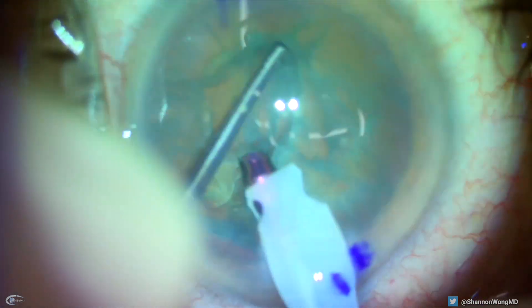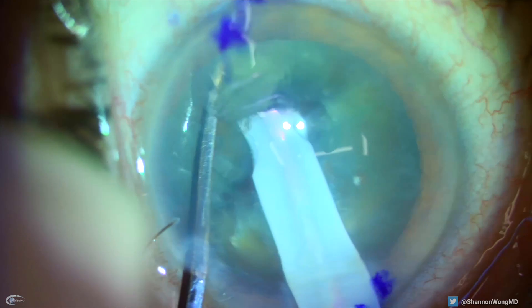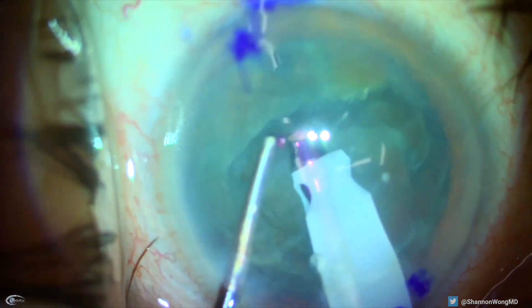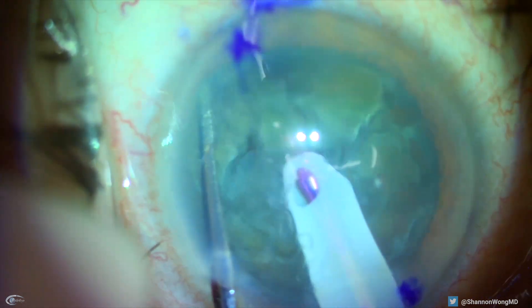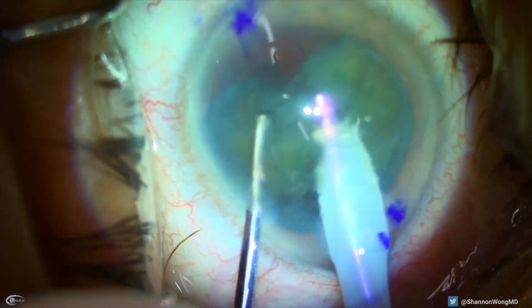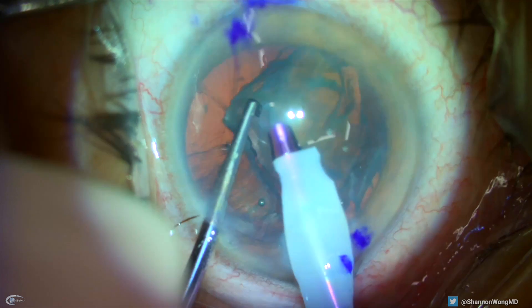Then we rotate the second hemi-nucleus and perform a second horizontal chop to split the lens into four quadrants. While actually performing the surgery, I thought the phaco needle broke the posterior capsule, but now I realized that my second horizontal chop actually created the tear in the posterior capsule.